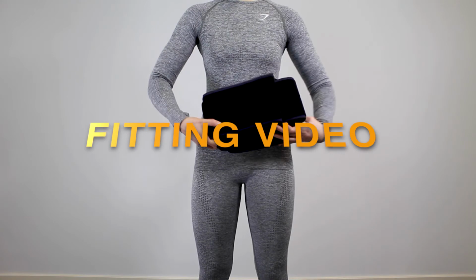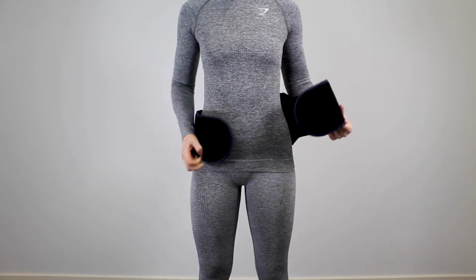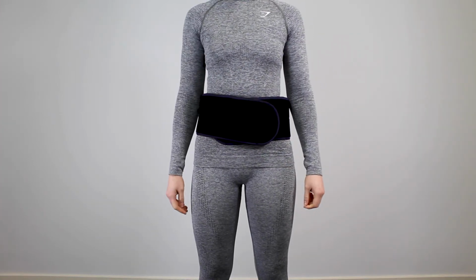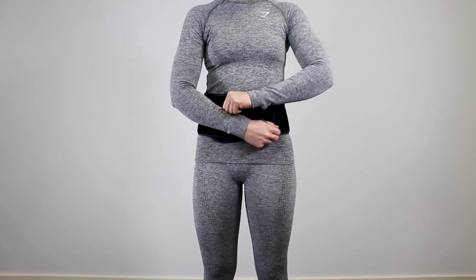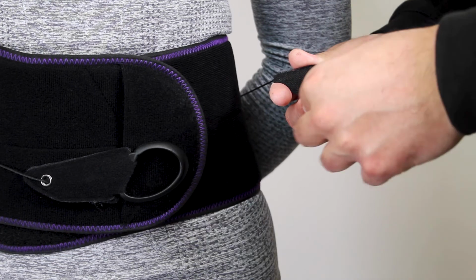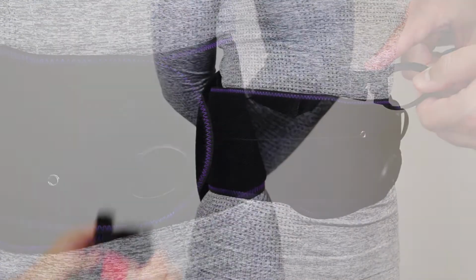Once the compression belt has been sized to the desired length, place the belt on the patient's waist. The patient can use the finger pouch for easier application, ensuring there is a 5-inch overlap. Pull the tabs tight and equal and place on the front of the belt. Adjust the pull tab length by removing the inner handle from the sleeve and winding the string around the spool.